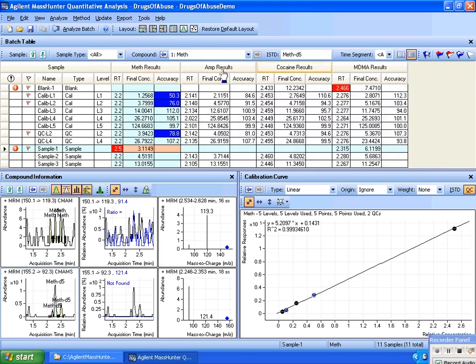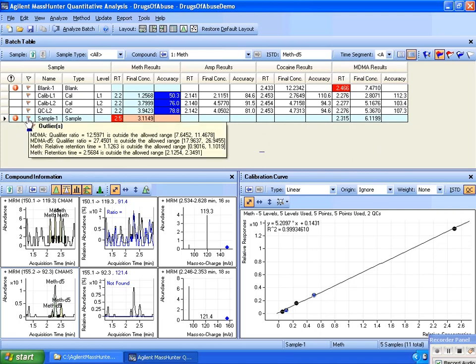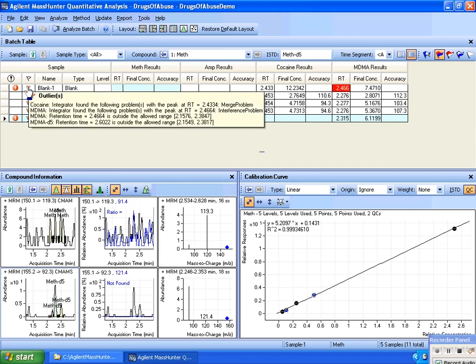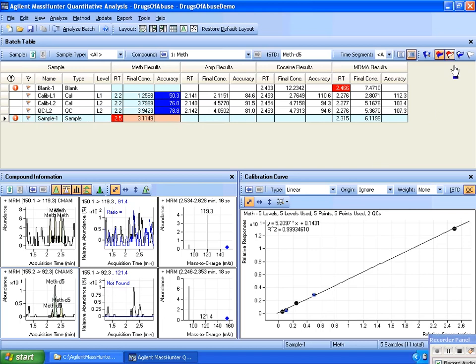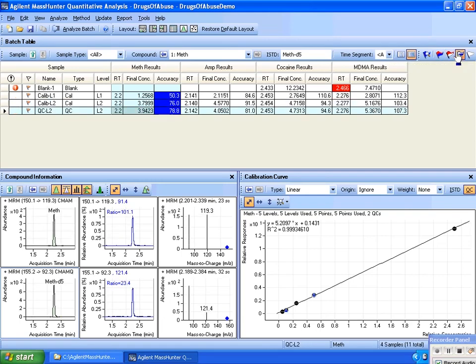So looking at all the compounds in this batch, if I click here on this flag, I'll get all the high and low outliers that have been turned on. As I can see here on the left, you get the warnings from the outlier flags for each sample by hovering over that particular icon. Now also I have the capability of just getting the high outliers, or potentially just seeing the low outliers, or I could see the samples which have no outliers.